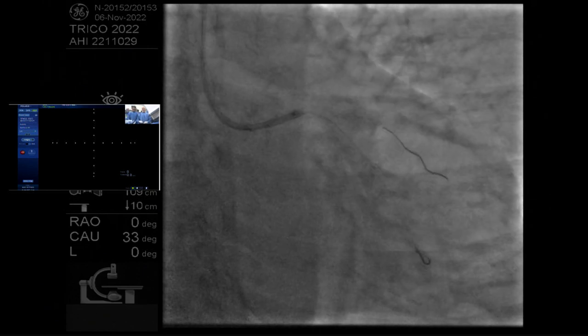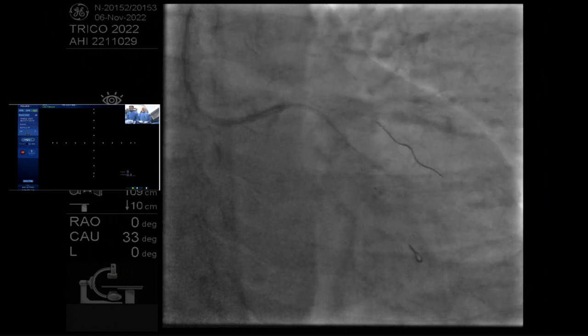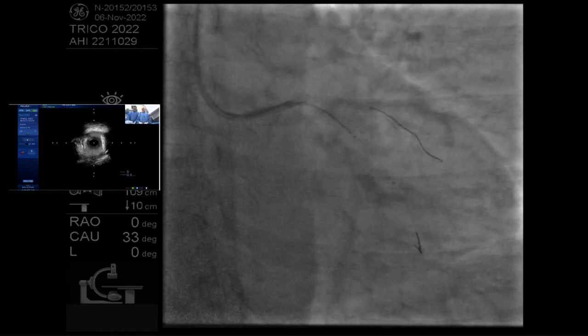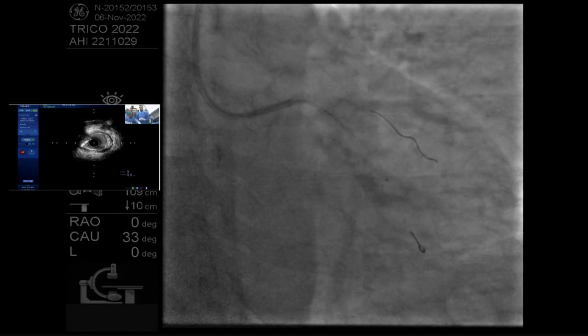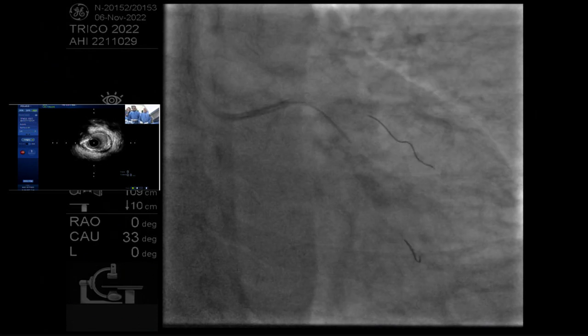What's the advantage again for the balloon inflation? It just gives you a general idea of approximately where your lesion is. So just stop there for a moment and go live on the IVUS as you advance it. Okay. So you see you're right in the middle of the lesion, right? So advance the IVUS a little bit. Push it forward a little until you get to your landing zone. So let's watch the IVUS now instead of the fluoro to make sure you're getting to a landing zone.